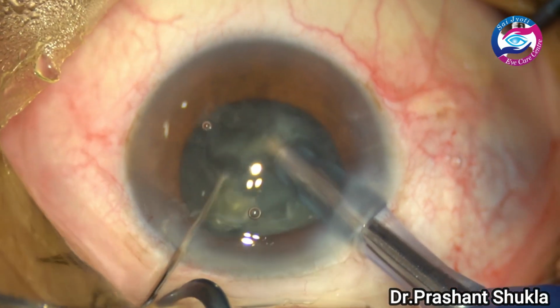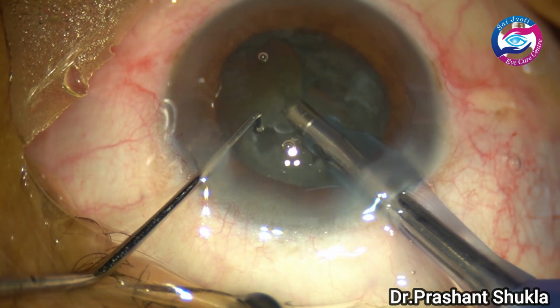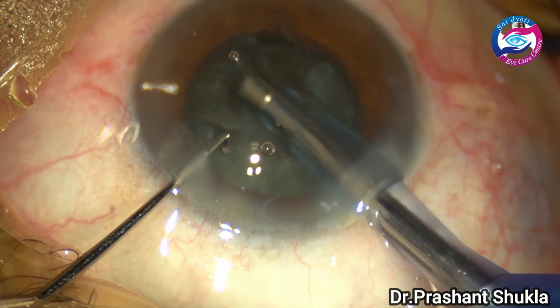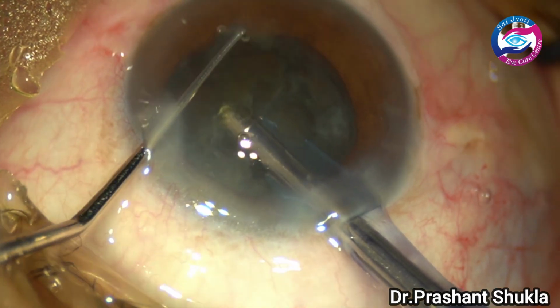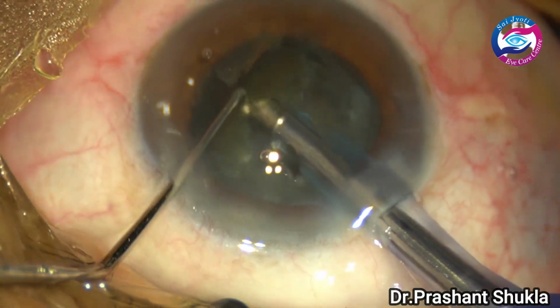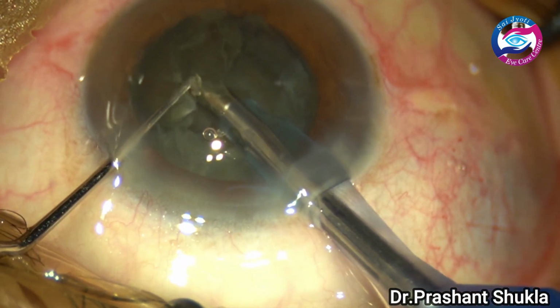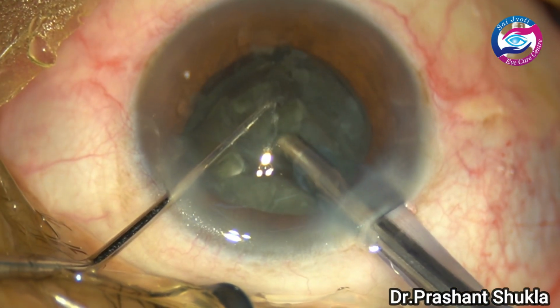The parameters have been changed, and I am trying to hold one piece of the nuclear fragment which has been separated, but as the nucleus is very soft, it is very difficult to hold it. So here I have changed the parameters. I have reduced the phaco power to the minimum which my machine is offering, that is 10, and now I am trying to hold it, because when I am using high power, the nucleus is just crumbling in front of it. The vacuum being used here is around 250 and the phaco power is very less, about 10, and I could get hold of one piece.